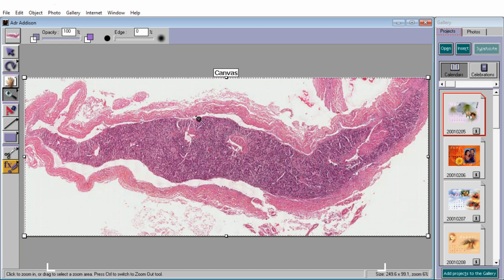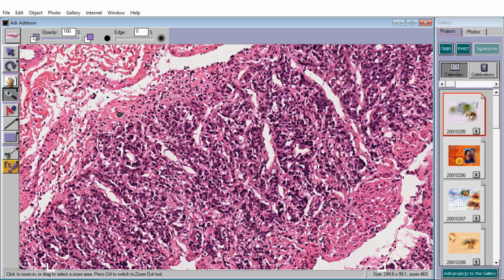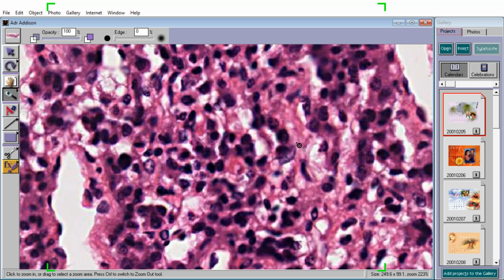So, having said that, how would you like to name this? Okay, look at, there's a whole bunch of lymphocytes here. There's some adrenal cortical glandular tissue that's being infiltrated with these lymphocytes. Here's a really good example right here. I mean, I can show you a lot of good examples. Well, because it's inflamed, you could call it adrenal cortical itis, I guess. Because it's being attacked by its own lymphocytes, you could call that an autoimmune process. Or how about if we call it autoimmune adrenalitis or autoimmune adrenal corticalitis, or chronic, because most of these inflammatory cells are lymphocytes. It's a chronic, long-standing process.